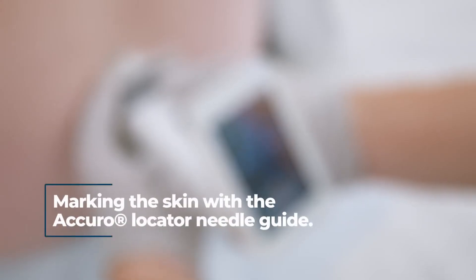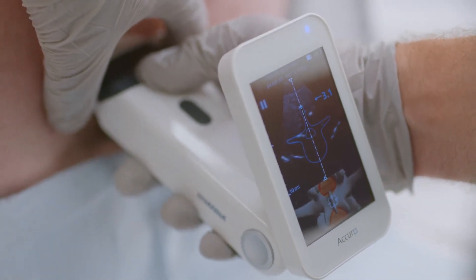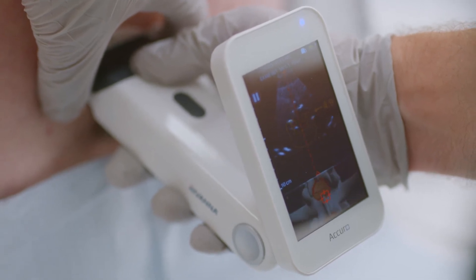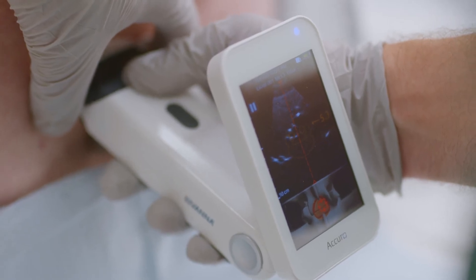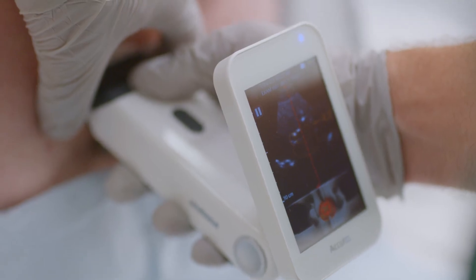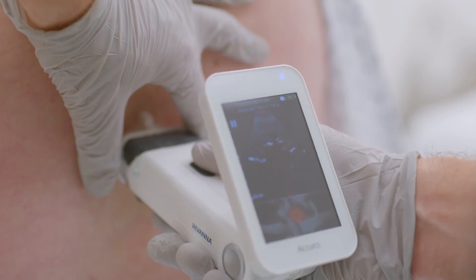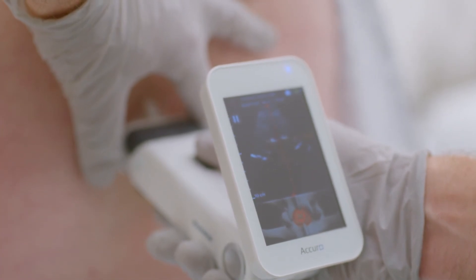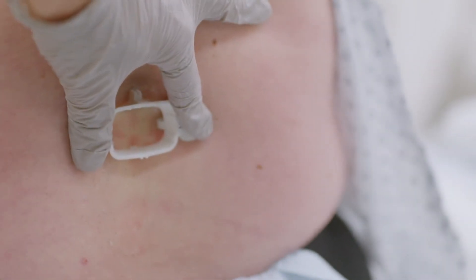Marking the skin with Accuro Locator Needle Guide. Locate the interlaminar space and midline. Use your dominant hand to hold the Accuro firmly with your non-dominant hand, thumb and index finger. Grab the locator inside the wings as close to the Accuro as possible. For best results, stabilize your non-dominant hand against the patient's back while holding the locator and Accuro in place. Keeping your non-dominant hand anchored and the locator steady, pull back on the Accuro device to release the locator.